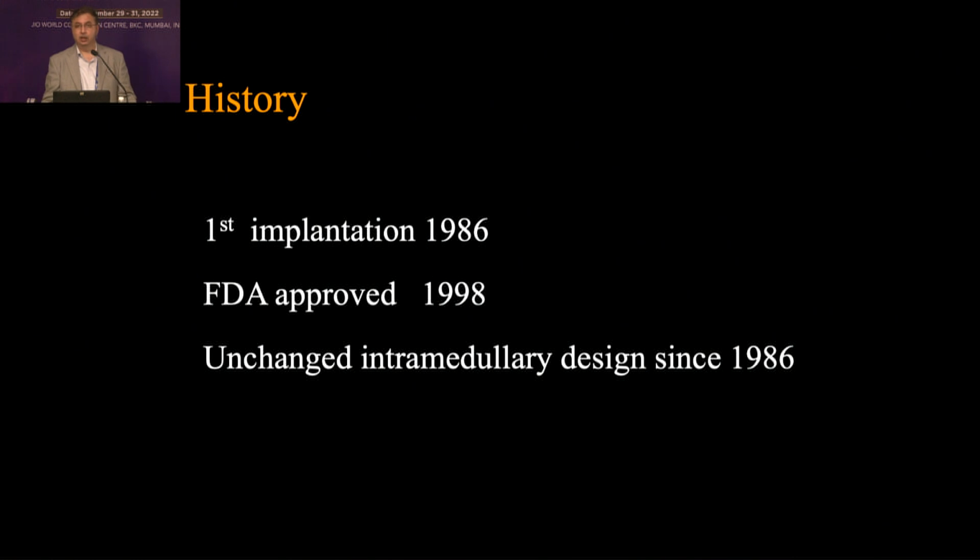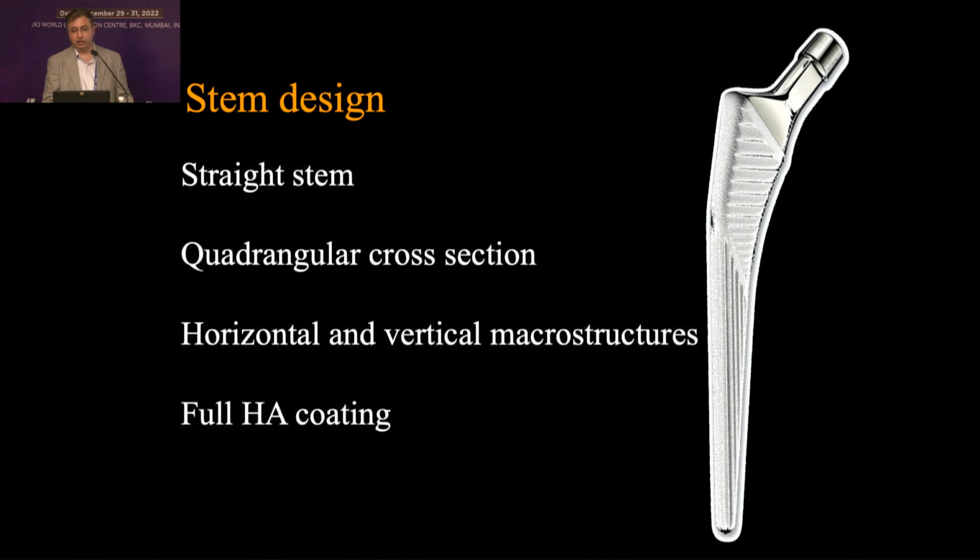Well, yes. By and large, the main advantage has been the history of that kind of stem, because the first implantation was way back in 1986. It was FDA approved in 1998, and the intramedullary design at least has been unchanged since 1986. And we know from past recalls and so on, that some of us have all been through, that history itself is very important. Longevity is what decides things in a hip replacement.